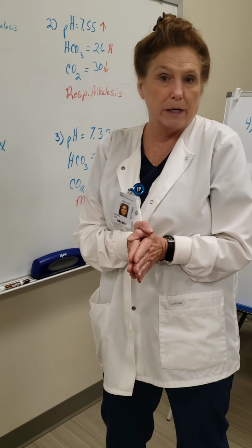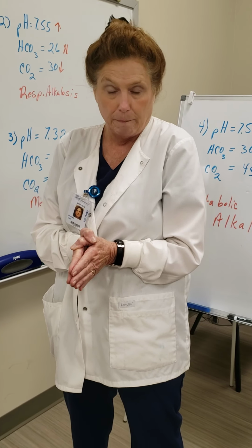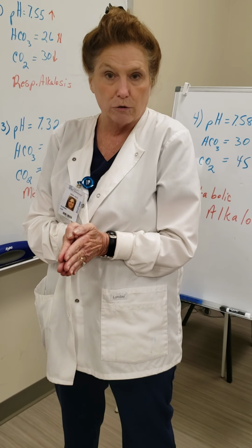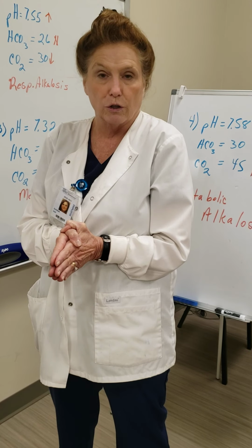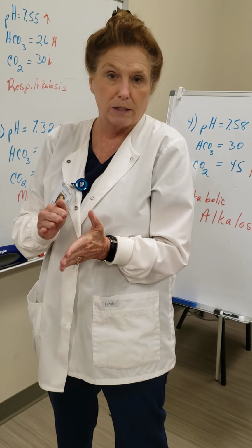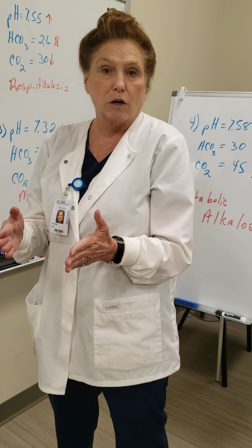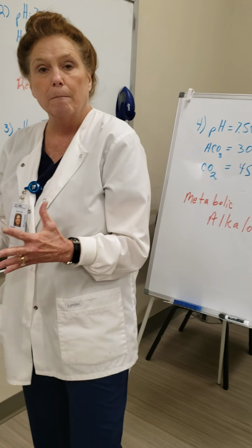You've got to learn to read an arterial blood gas report, or ABG. Remember, the lab doesn't draw these, respiratory draws these. This is the best way to know for sure the status of your patient's carbon dioxide and oxygen level, and if things are off so bad they've been thrown into acidosis or alkalosis.